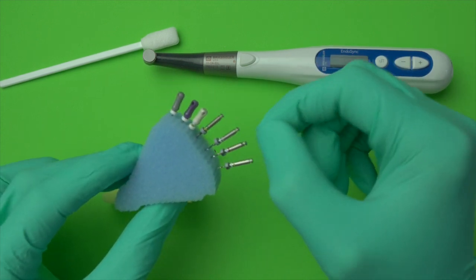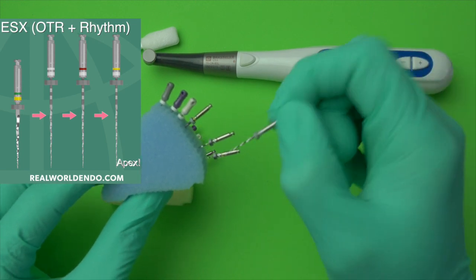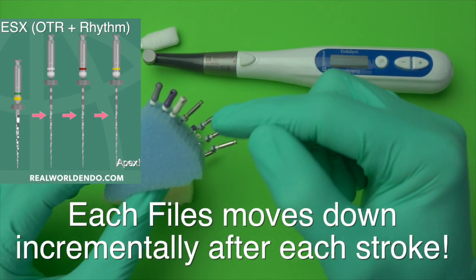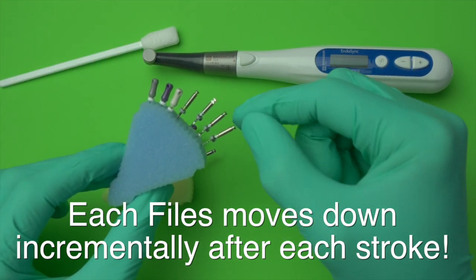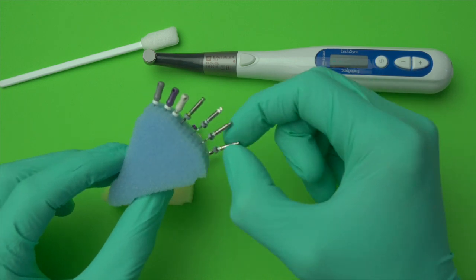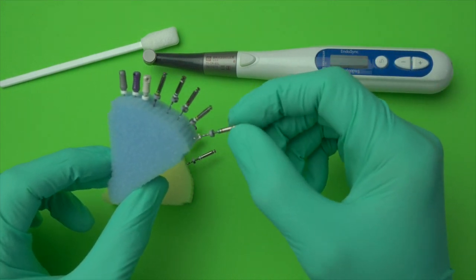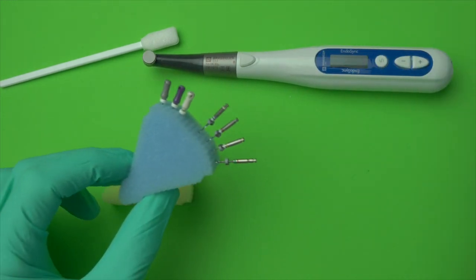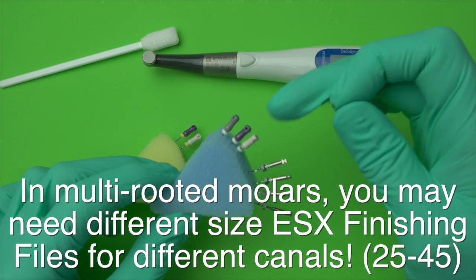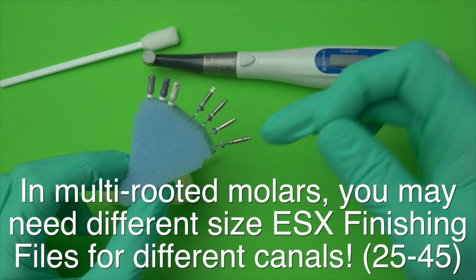Occasionally with a tough tooth, do a little more hand instrumentation and go back to the beginning of the cycle: 1505 three strokes, then 1504 three strokes — on the second cycle you'll very likely be down at the end. After a couple cycles of hybridization of tapers, measure working length with your 1502. Once you have the analog reading captured by moving the stopper, follow up with your ESX finishing file — a size 35 again here. Not counting the orifice opener, this ends up being about four files for your advanced cases. The key is hand filing to create a path, then hybridization of tapers, then a finishing file.